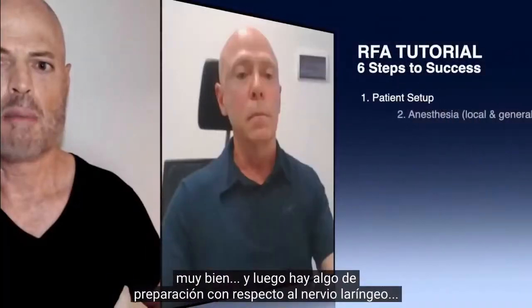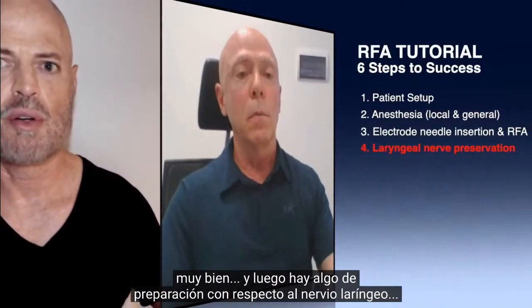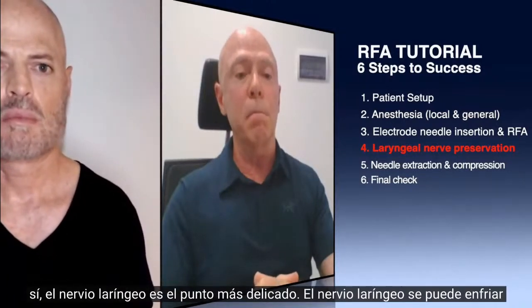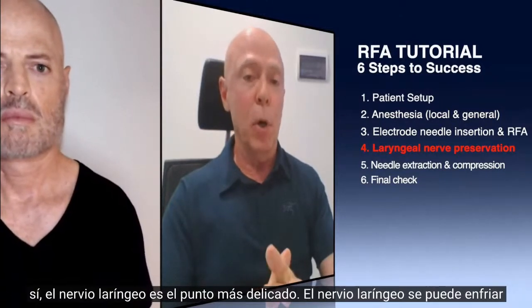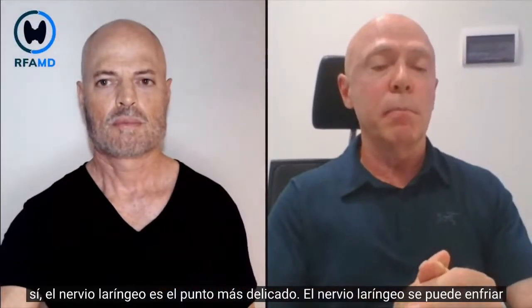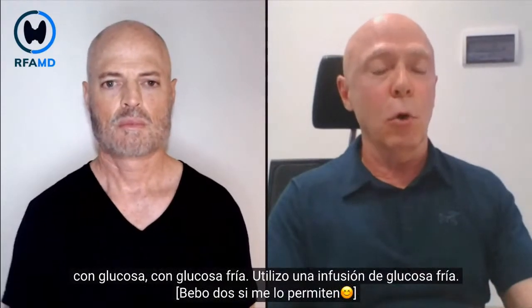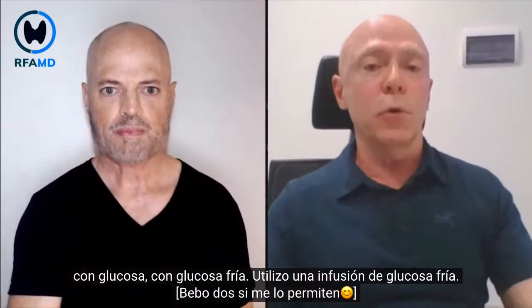Very good. And then there's some preparation in regard to the laryngeal nerve. Yes, the laryngeal nerve is the most delicate point. The laryngeal nerve may be cooled with glucose, with cold glucose. I use cold glucose infusion.